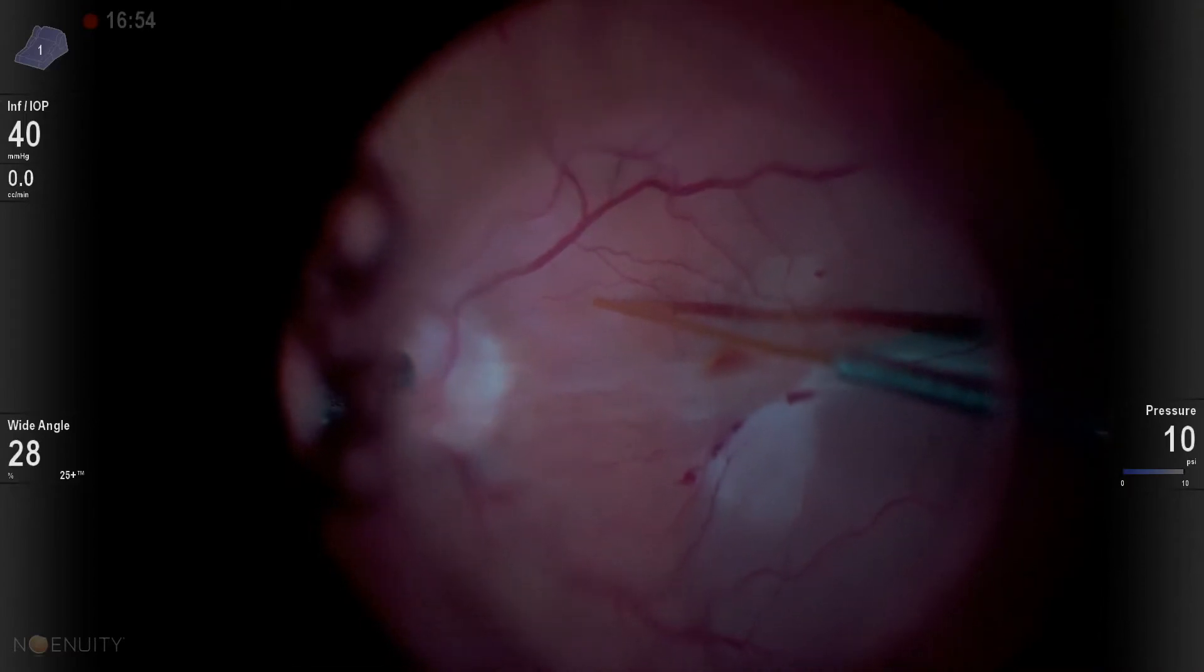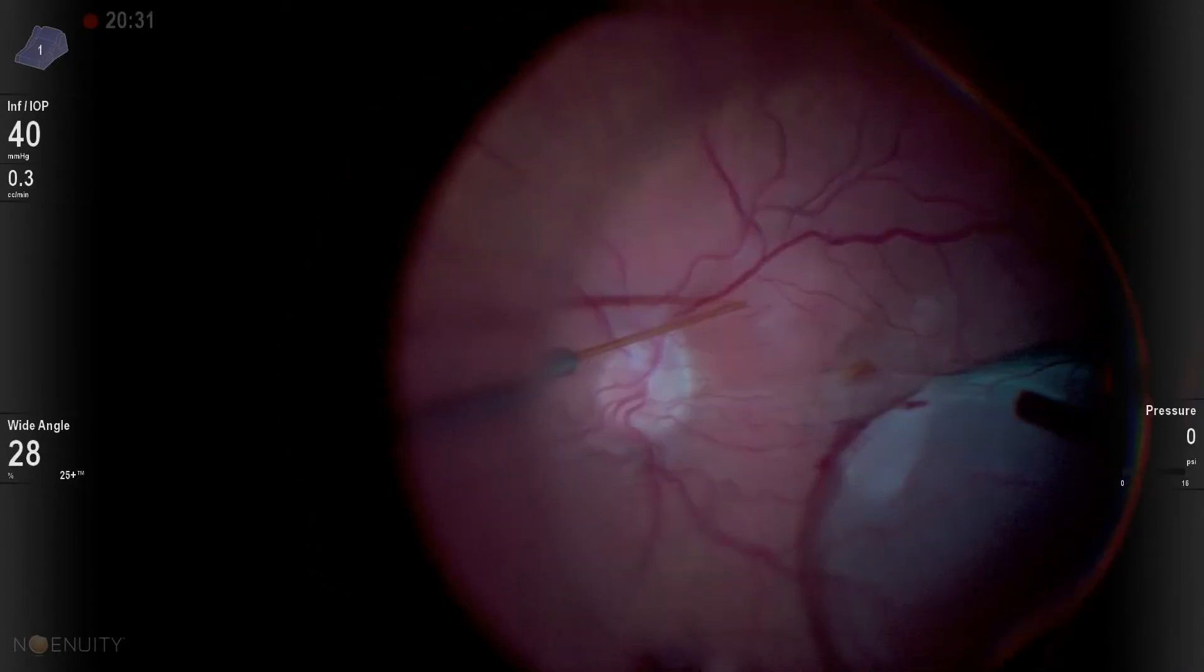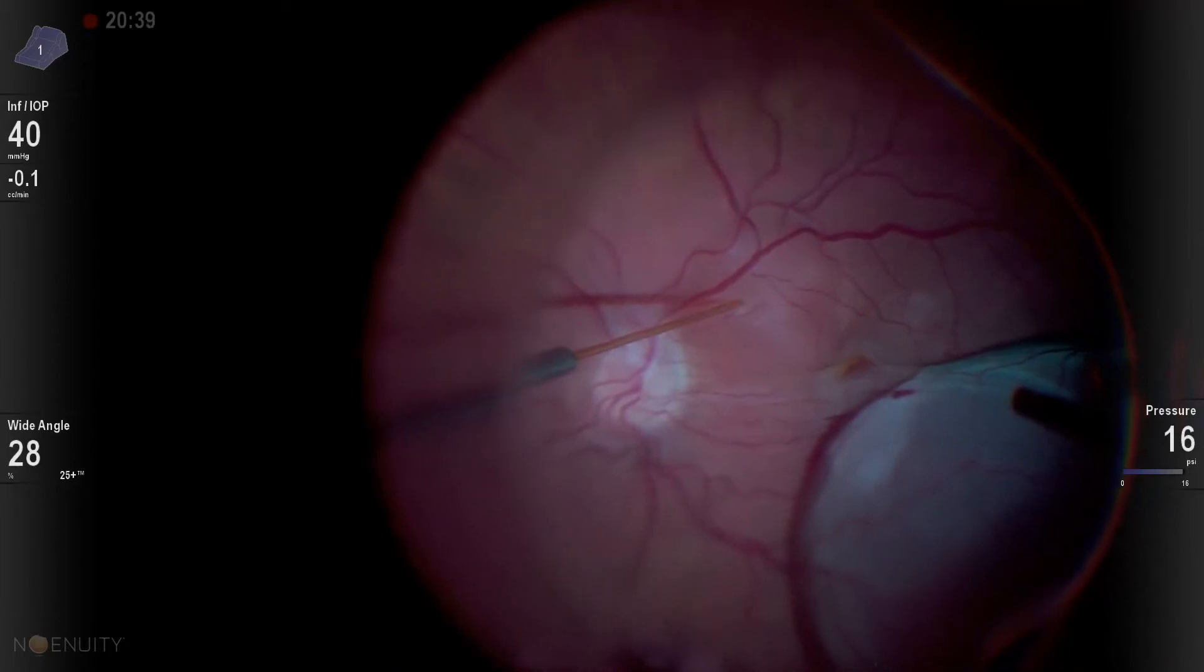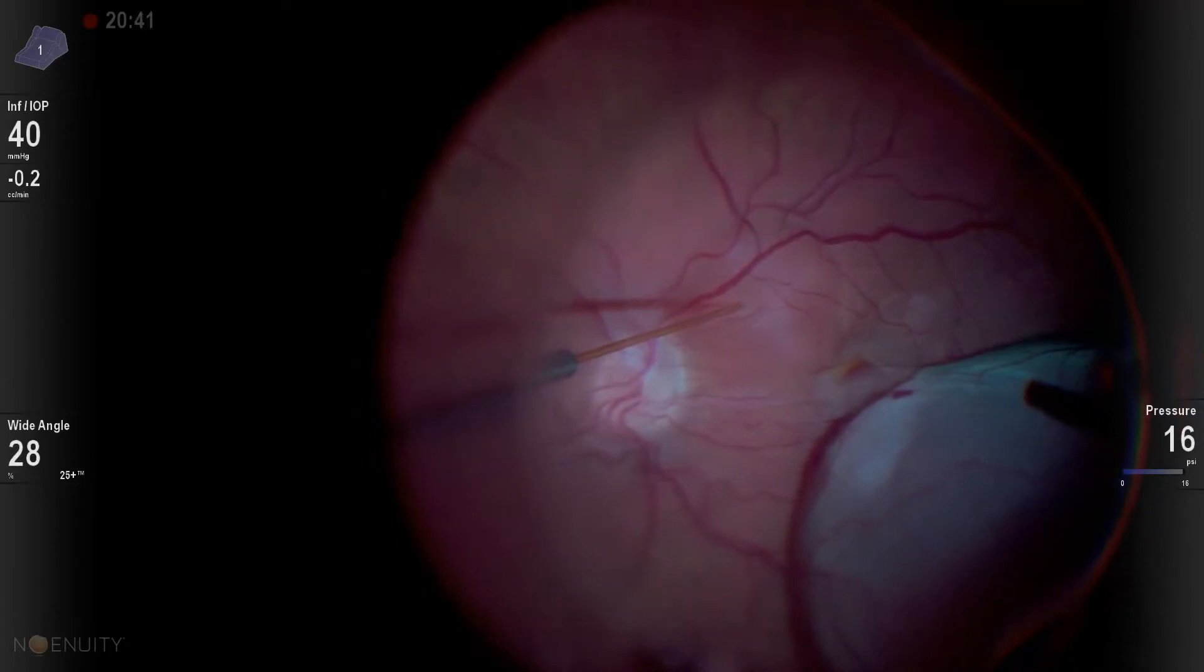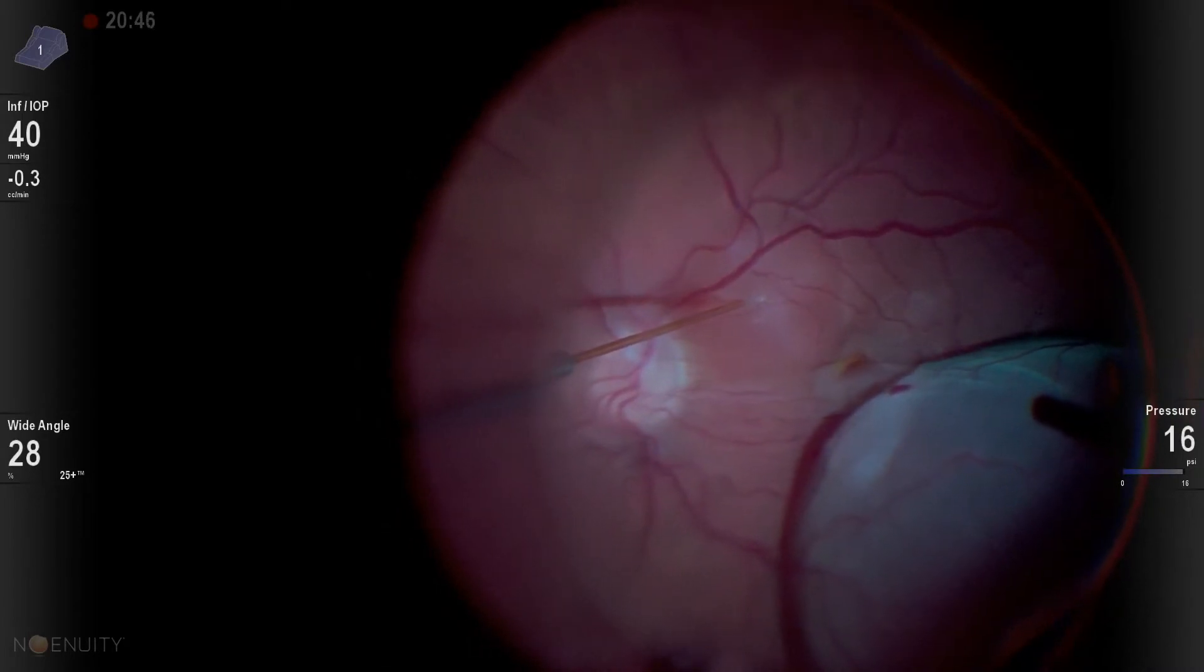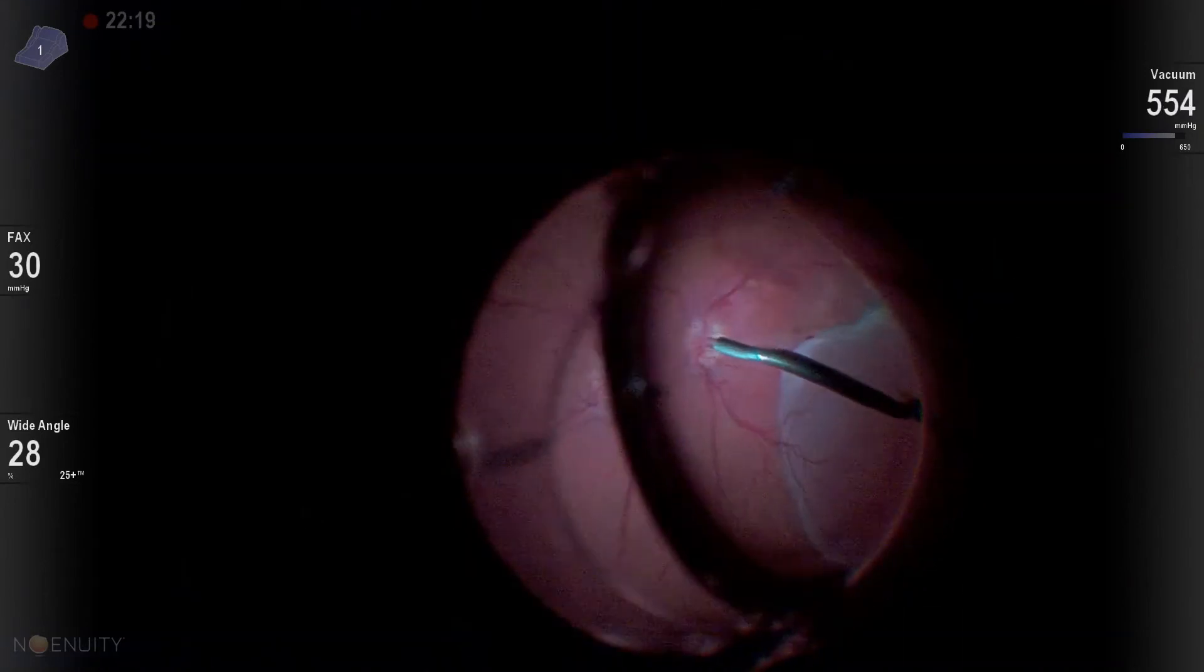So after blowing up several of these different blebs and having really no success with anything going into the macula, I'm left to try and figure out what our best option is for how to drive this large, bullous amount of subretinal fluid into the macula. And so what I end up doing, I try left-handed, thinking maybe a different approach would allow this to dissect more to the macula, and you can see that it just doesn't.